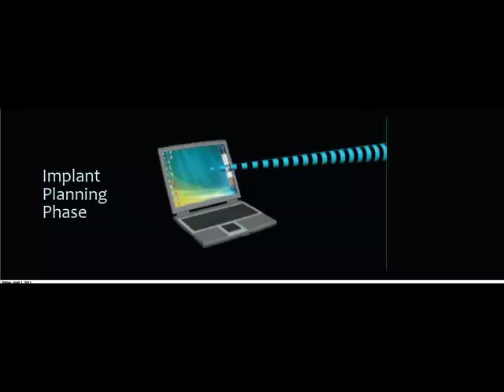And now we can even do an optical scan of the patient's model to capture the soft tissue, capture the margins of the soft tissue, and be able to create the proper emergence profile of our implants to match the hard tissue and the soft tissue now.